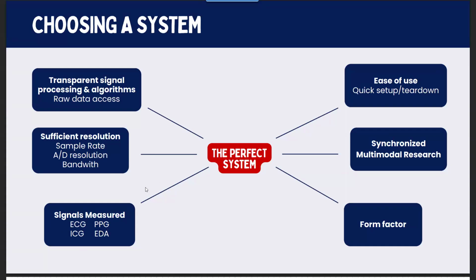Most important of all, if we're working with just ecological data and wanting longer measures of continuous collection for things like heart rate, commercial devices are great, but if you want to look at multiple measures at the same time, it may not be the best solution for you.